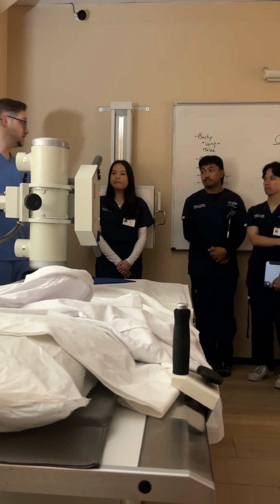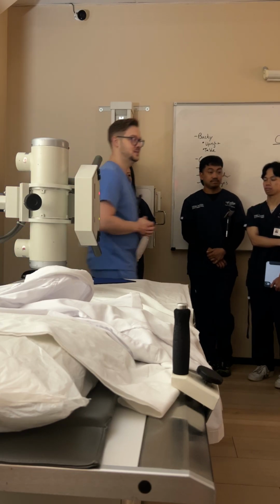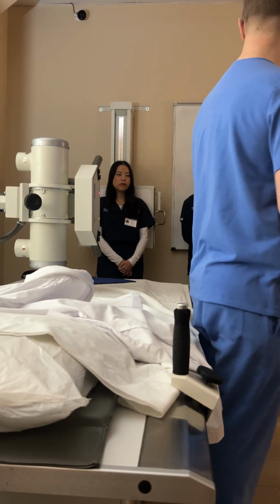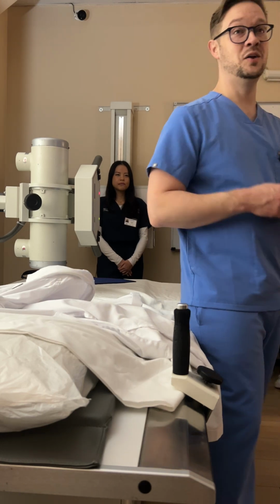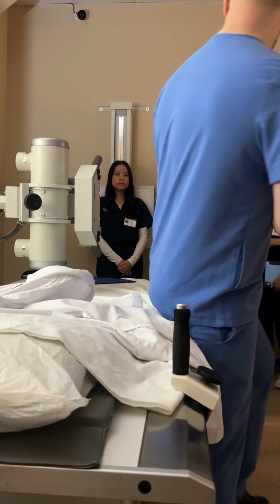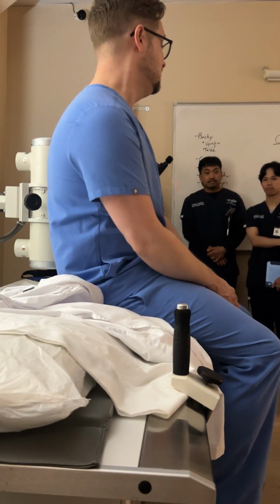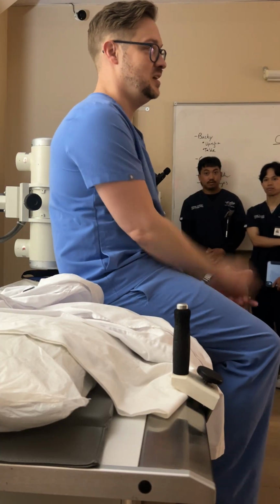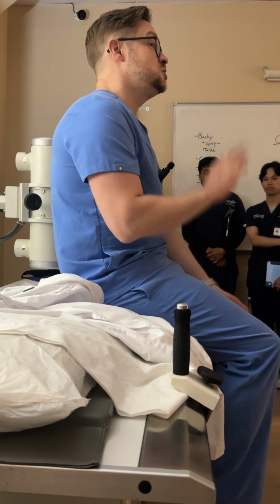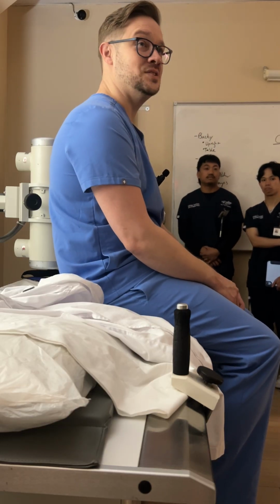However you do it whenever you graduate and become a tech, that's on you. I've got to teach you the book way. Questions? And you'll also find when you get out of this program that most techs just do a chest x-ray on what? One inspiration. Why? Because techs can be lazy and they are worried that if they have a patient breathe on the second breath, that their lungs will go outside of their collimation and then you'll have to reshoot it. So they're like, if I just do it on one, the inspiration won't be as big, so it might not be off my film. Right? Questions?